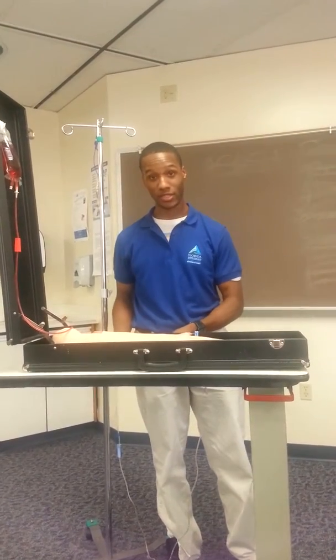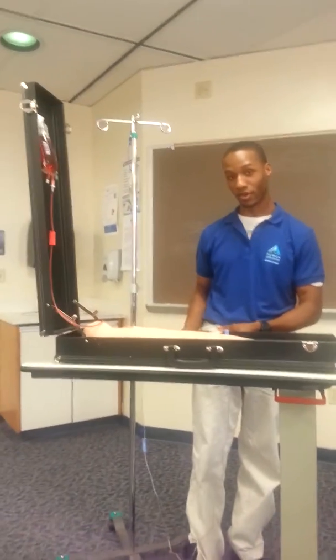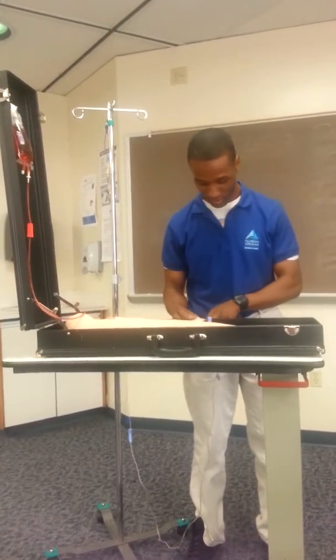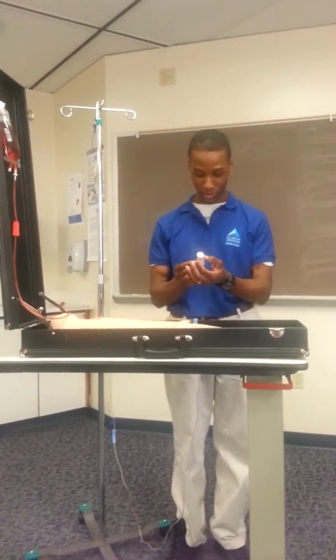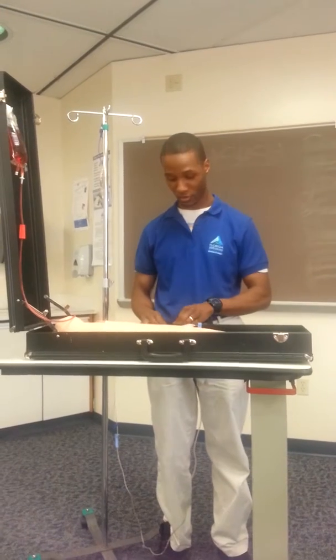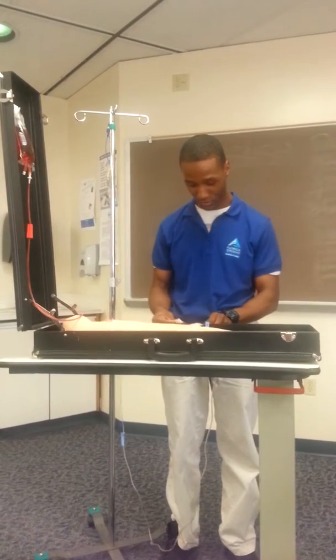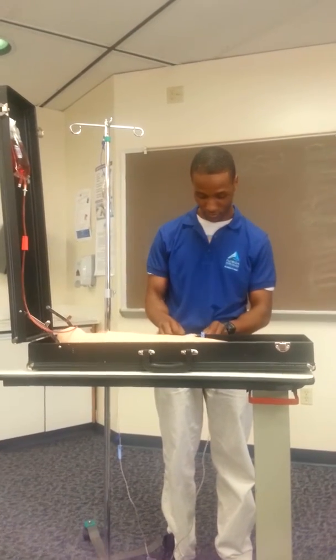And I've done my calculations, and my drop factor is 4 drops per minute, and I will be administering an amount of 0.3 mLs of the drug. So I'm going to check the drug of Zosyn, make sure I'm matching it up with my MAR, and making sure that's the correct drug. And I'm going to check my expiration date. I'm also going to look over the MAR, make sure I check for the patient's history, any kind of allergies, anything of that nature. I'm going to then clean off the tip of the Zosyn container.